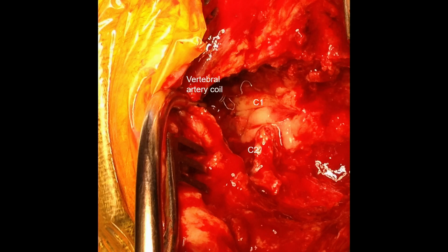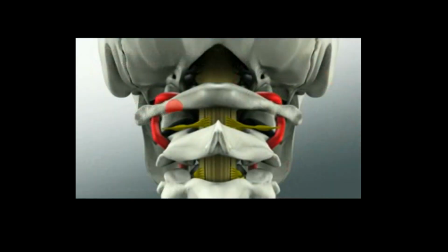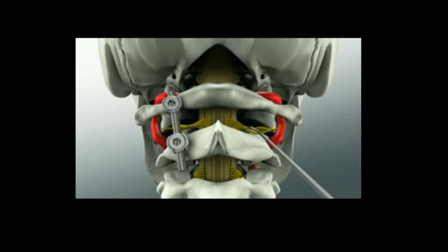So that's not usually a typical picture that I see when I operate on these, and you have to run the thing. So, here are the things that are important. This index case was not done at UCSF, but if you have, first put in the screw on the non-dominant side, but if you have vertebral artery injury, the key thing to do is to initially not put a whole bunch of Surgifoam on it because it'll embolize, and I think that's what they did at that outside hospital. No Floseal, no Surgifoam.